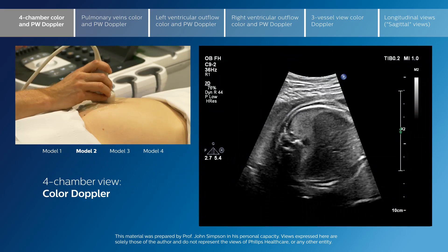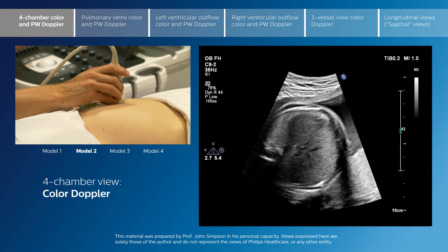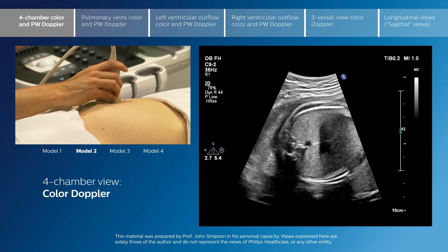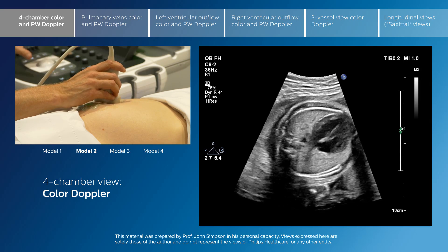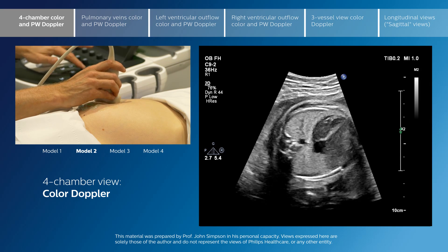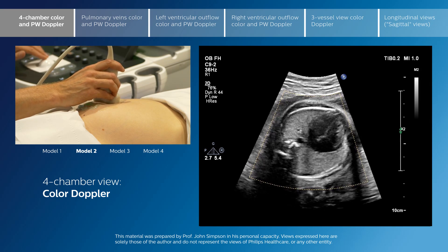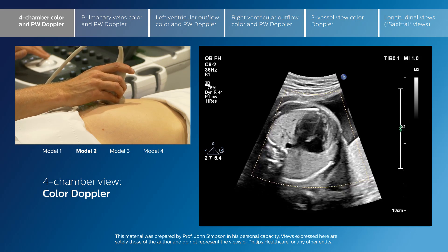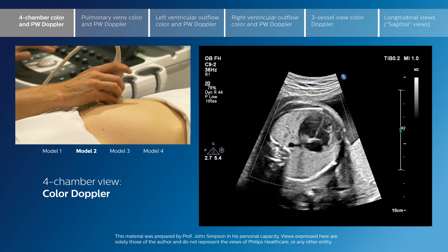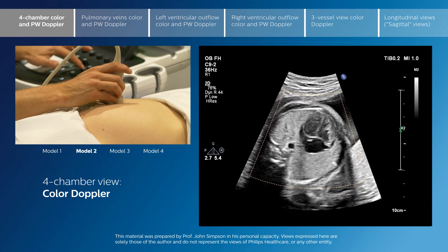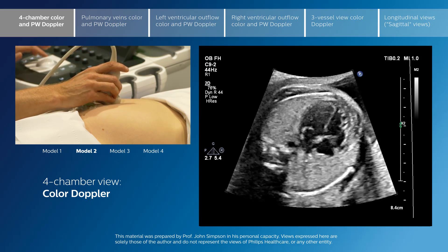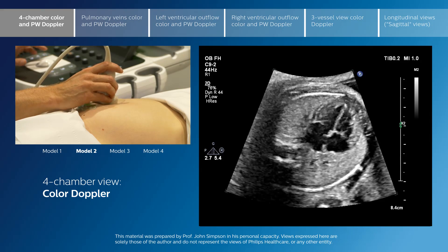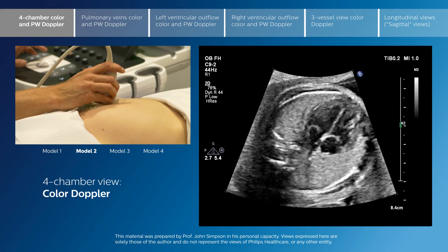What we suggest is that once the views of the heart are obtained in cross-section, the use of colour may be extremely helpful to confirm the flow into the heart and the flow in the great arteries.